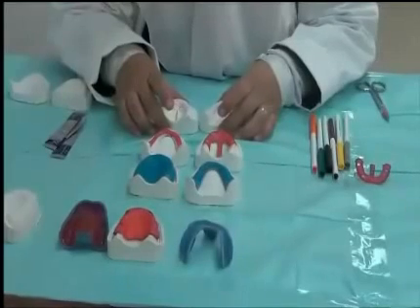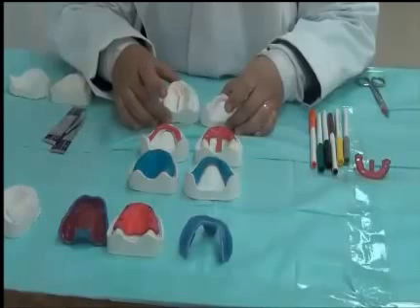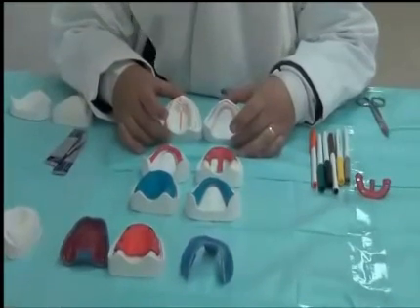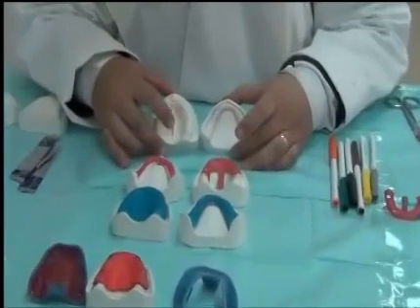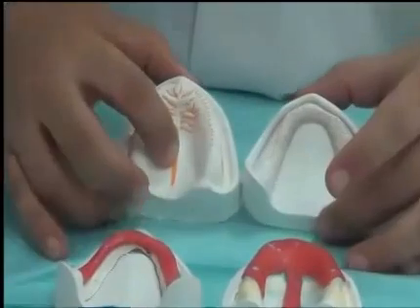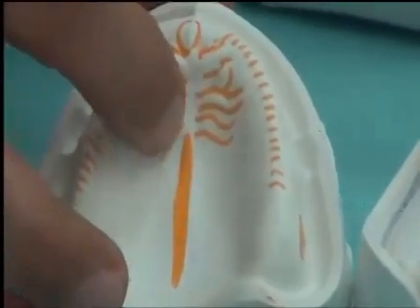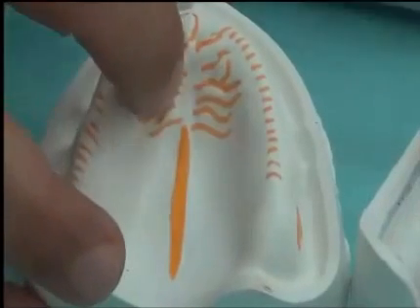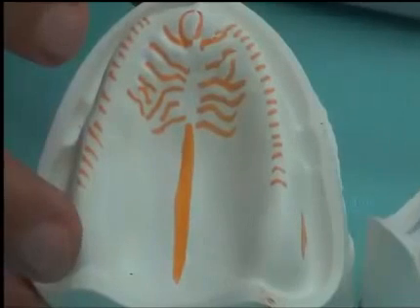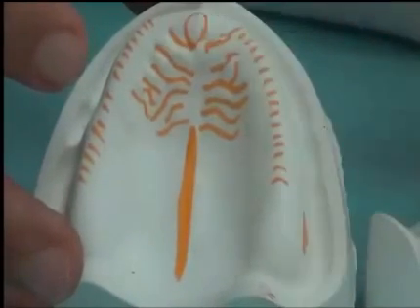So we have talked about the quality of the mucosa and the soft tissue beneath the denture. We said that beneath dentures we have multiple qualities of soft tissue and bone. So if we look at this area, this will have thin mucosa and sharp bone, so we should relieve it. This area has thick mucosa but very irregular, and they are oblique in orientation, so we also need to relieve them. Under the incisive papilla we have a bundle of blood vessels and nerves that can be compressed, so this is an area of relief.